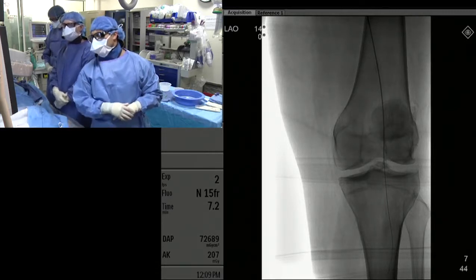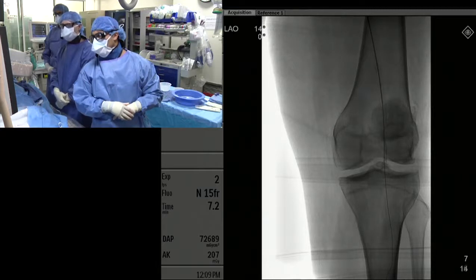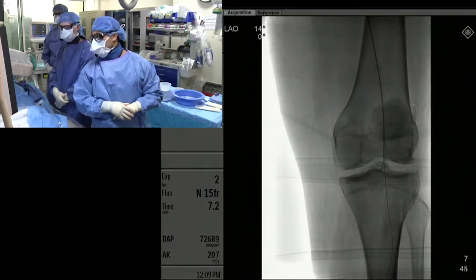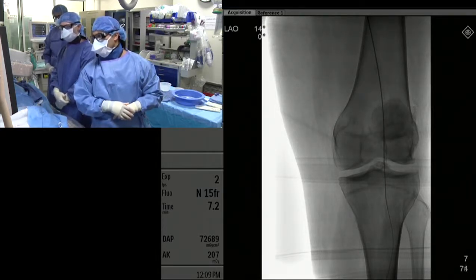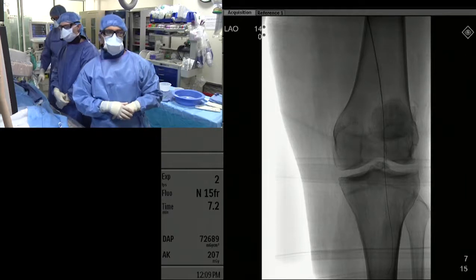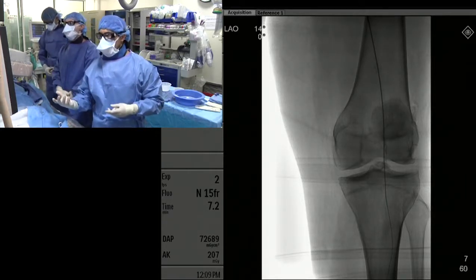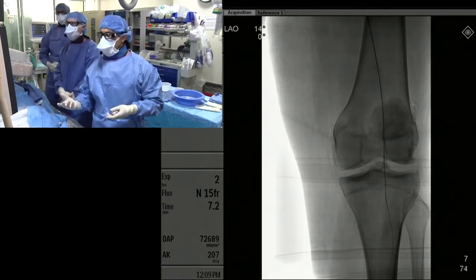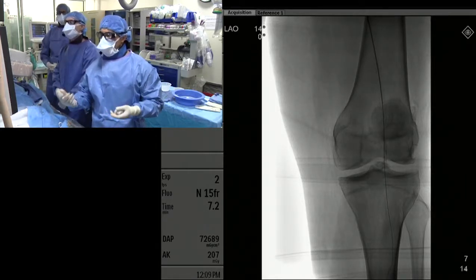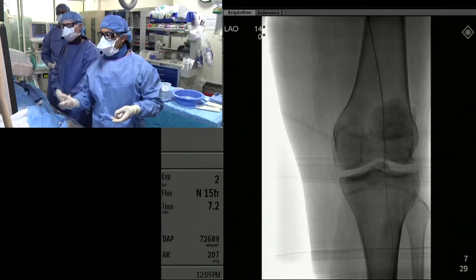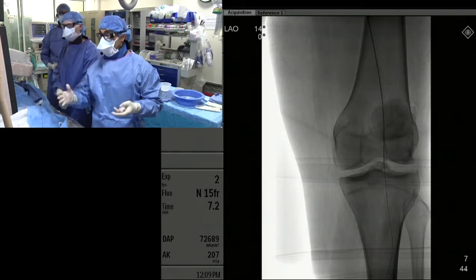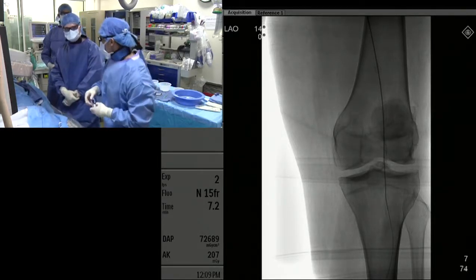This is a four-French glide catheter at 150 length. You can see we're actually able to get this beyond where there's a severe stenosis. So if we need to stent in this location, we can stent successfully with a 150-length stent without trouble.